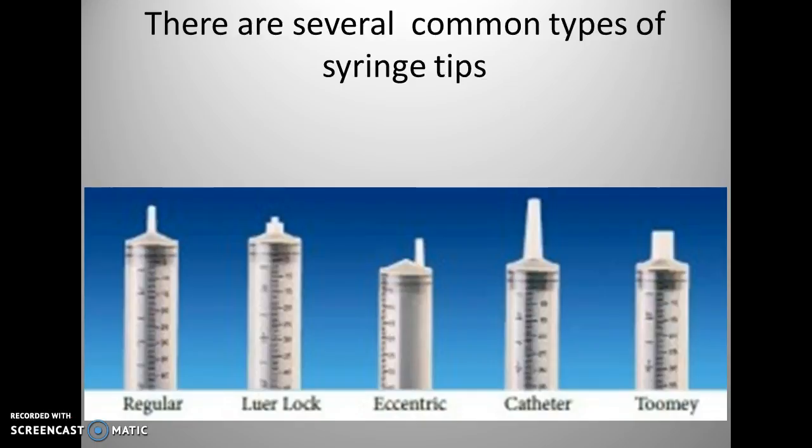And then you have this here. This is a catheter tip. Also can be considered are oral syringes. Here again, oral syringes. These types have tips larger than the slip tip. They are used to administer liquids by routes other than parenteral administration, and needles will not fit.